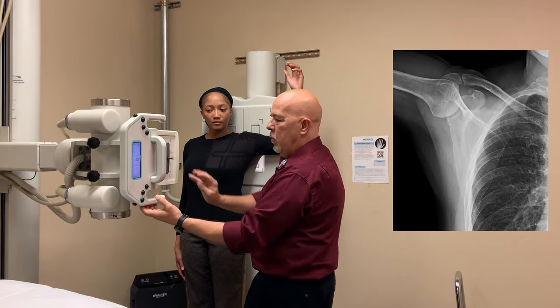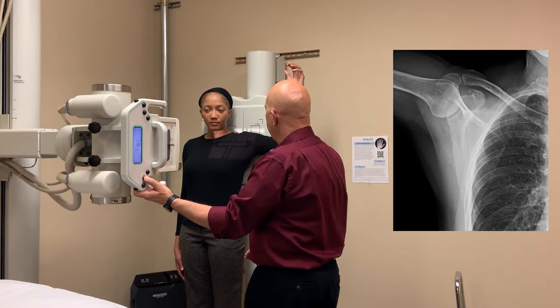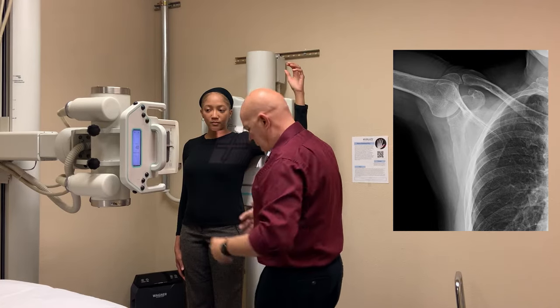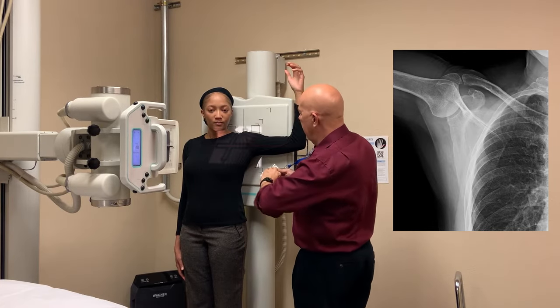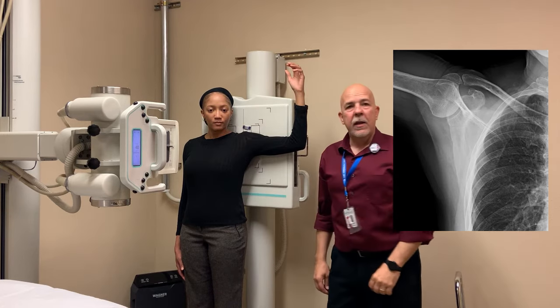Collimate. I'm going to raise this up a little bit here. Place your marker — this is your left side. And expose your film.